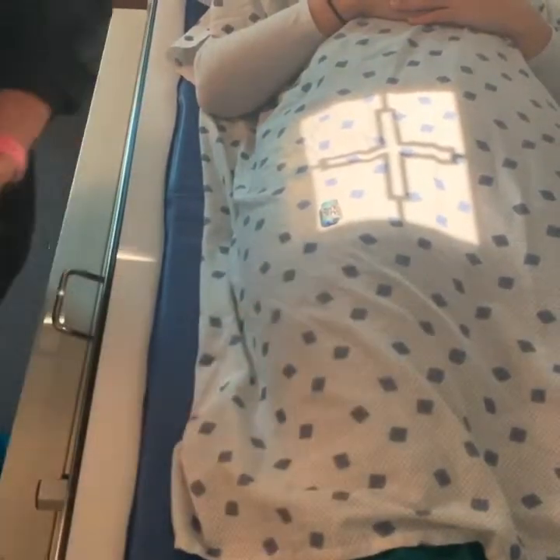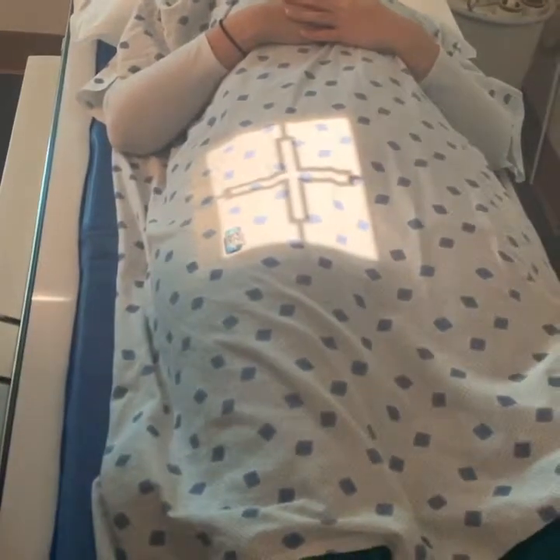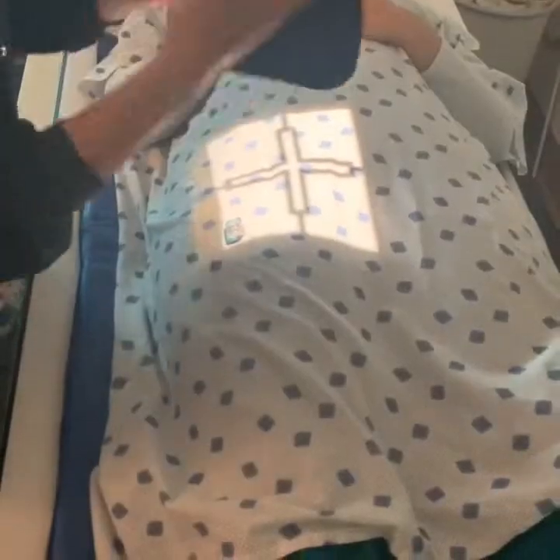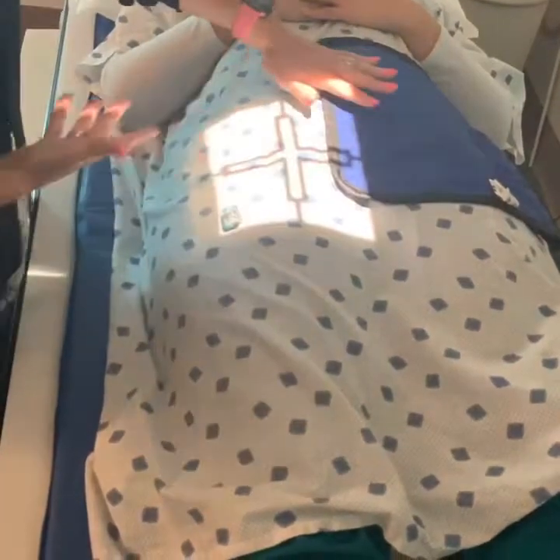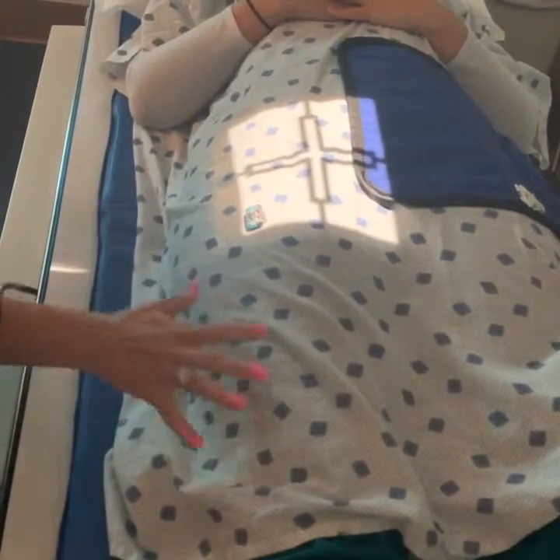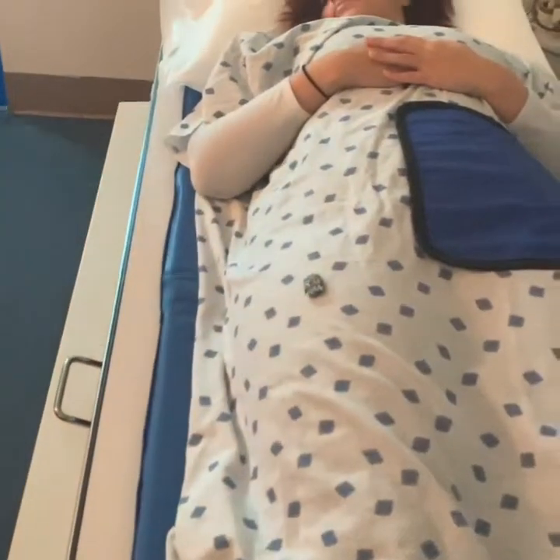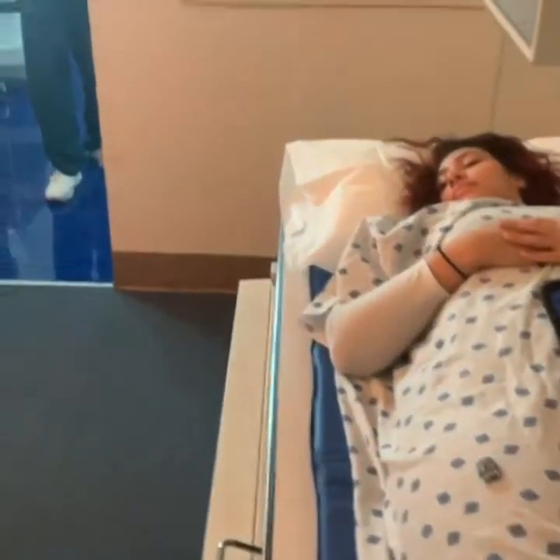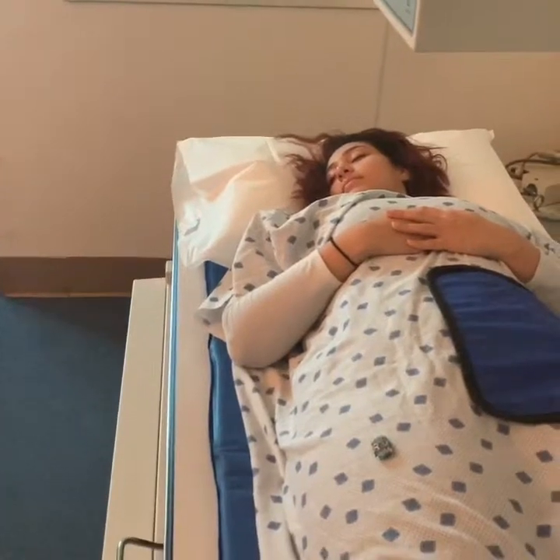I can't shield on this one, so I'm not going to put it on her. If she was really that young of a patient, I could probably go like this and attempt to shield one side. So we can do that just because she is young. I'm gonna have you hold just like that and then stop breathing when I tell you to. Okay. All right, hold still right there. Same technique, 80 at 12.5. Good. You can relax your leg.